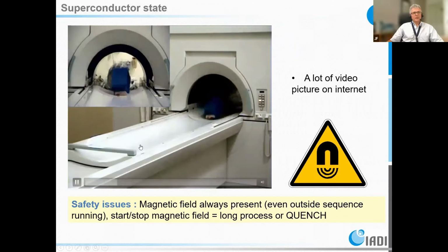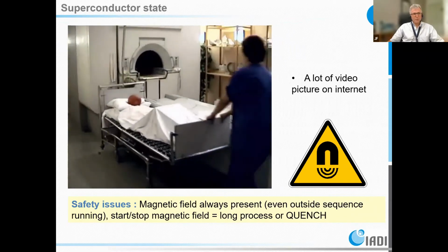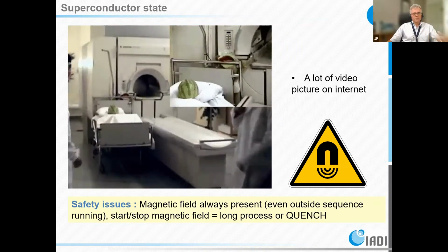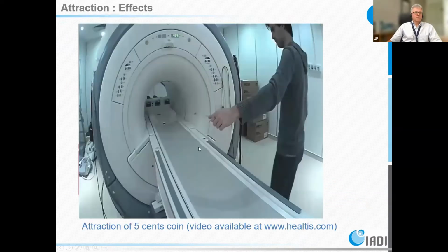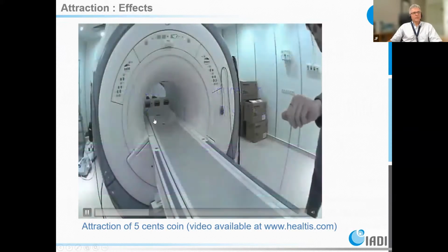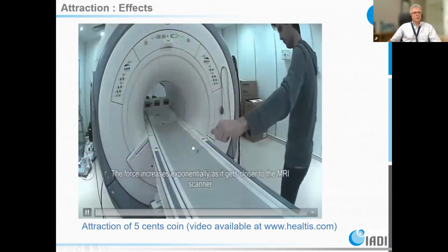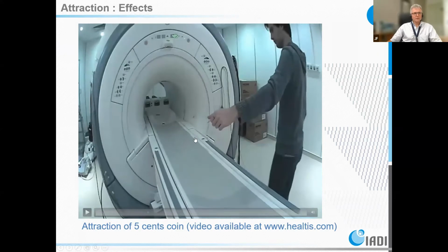And this is, I think, the main issue for workers and also for us, to see if something is coming very near to the system, it's dangerous. We ran some experiments here, and this is only a 5-cent coin. Here you see the coin. You go closer, you see the attraction. Even a small coin is attracted in the system.